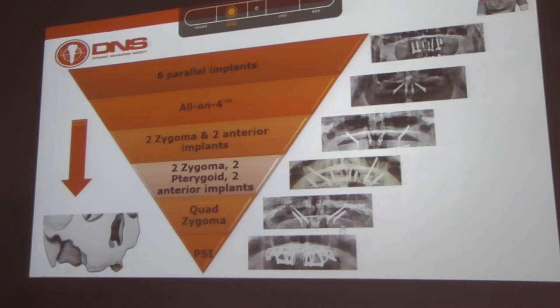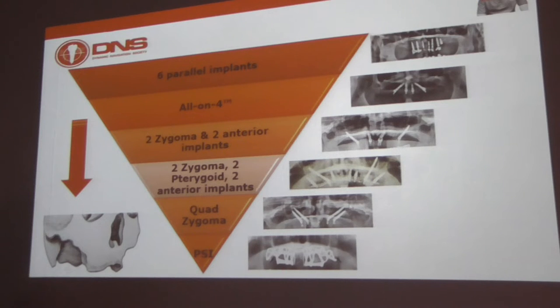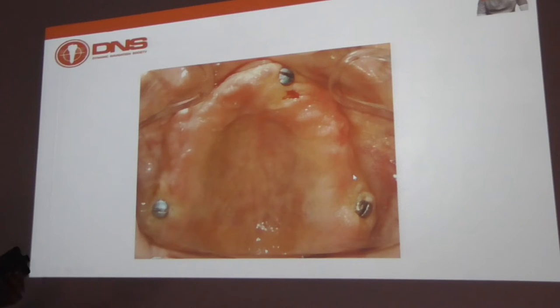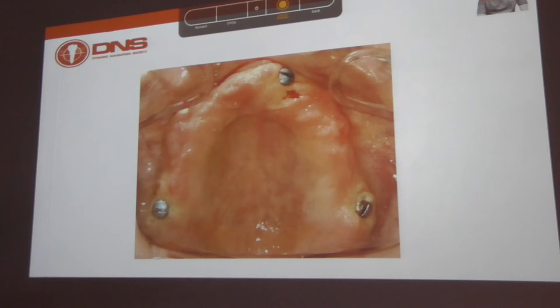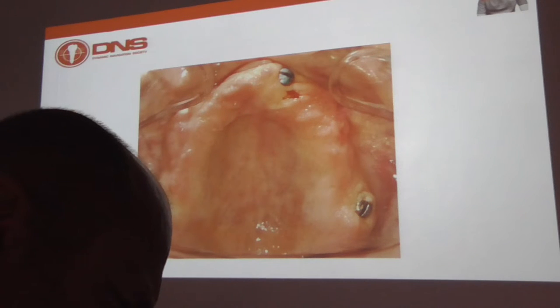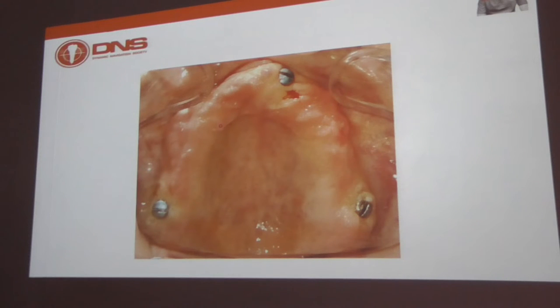Coming to the quad zygoma case, like we discussed, we need a physical denture with bone screws. I put three bone screws only for one reason, because this is the area where we would put the remaining two bone screws when we put five or more, and these areas are where I have to raise the flap. With time I realized having them or not having them did not make a difference in my case, so now I don't put them. But for sure, 5 is better than 3.